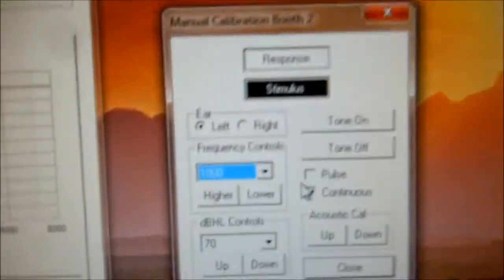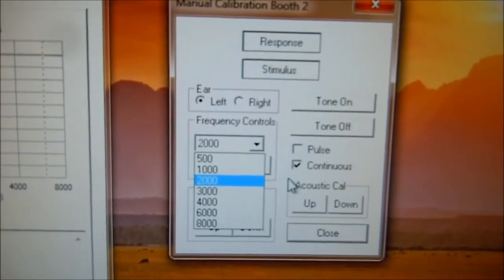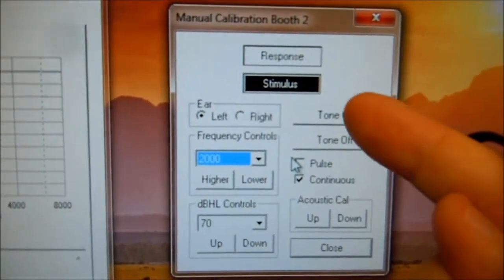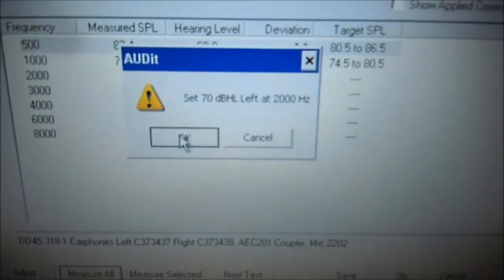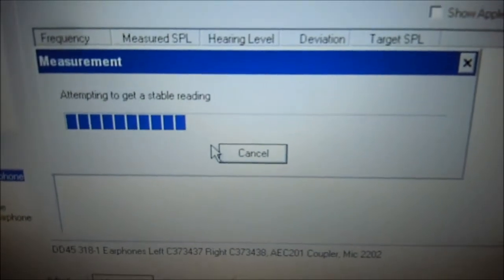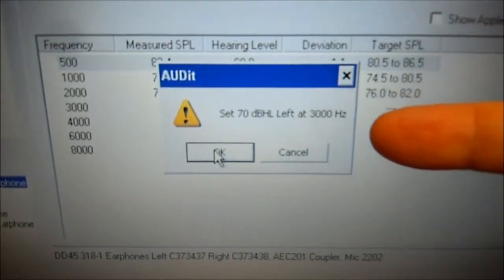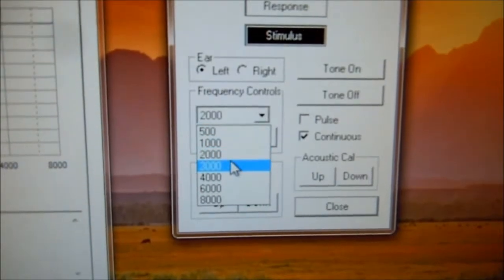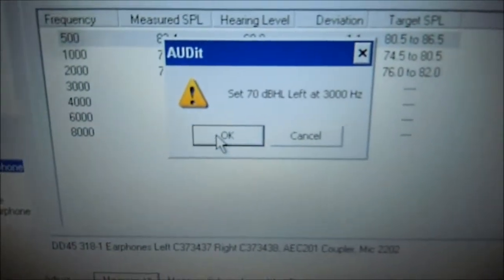Next we set 70 dB at 2,000. Come back to the audiometer software, select frequency to 2,000. It's at 2,000, 70 dB, continuous. Tone's already on. Come back to the audit software and click OK. It performs its measurement, and we continue this to 8,000. Now it's asking us 70 dB at 3,000. Change this to 3,000. Come back to the audit software, press OK.